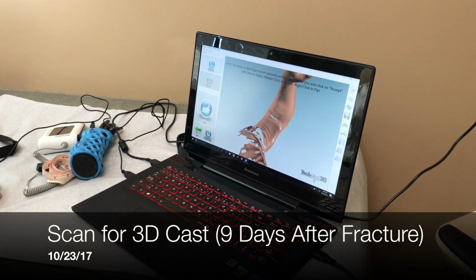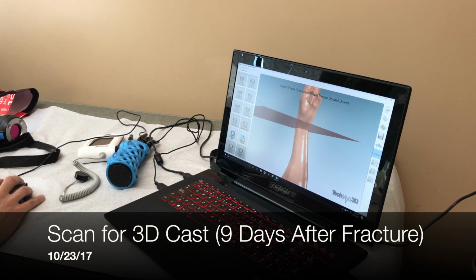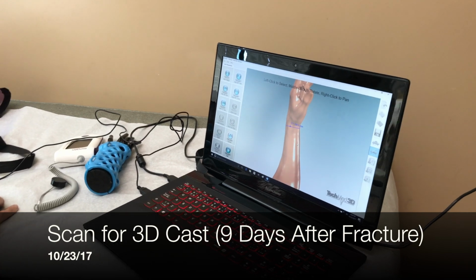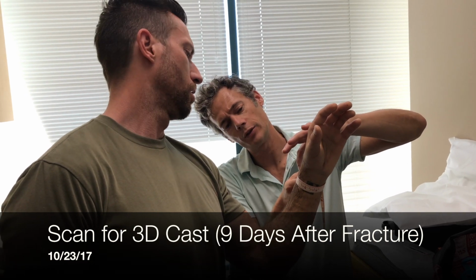So now that James has done the scan, it gets sent to the computer, which will generate this image, and it will do a digital measurement, as you can see that plane going around my wrist. And then James will double check that with a physical measurement of my wrist. And we'll see that process going on right now.